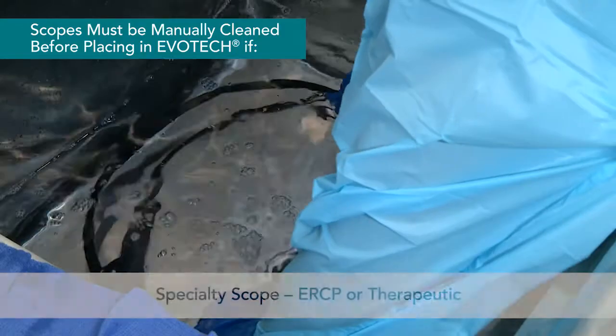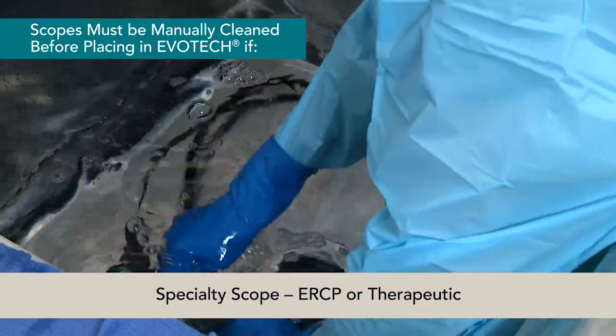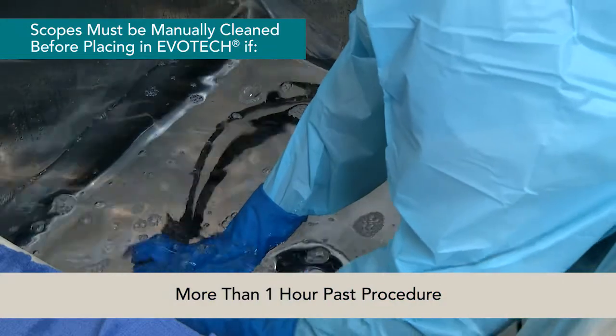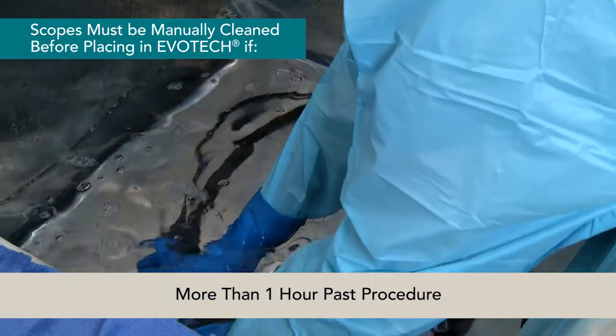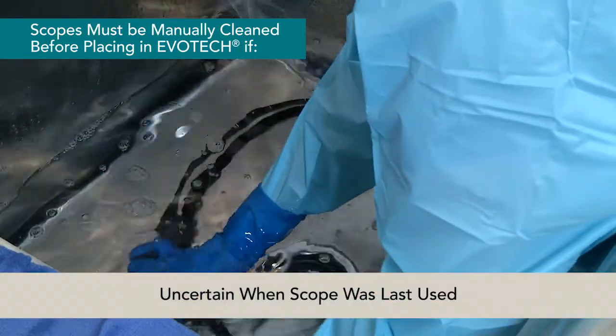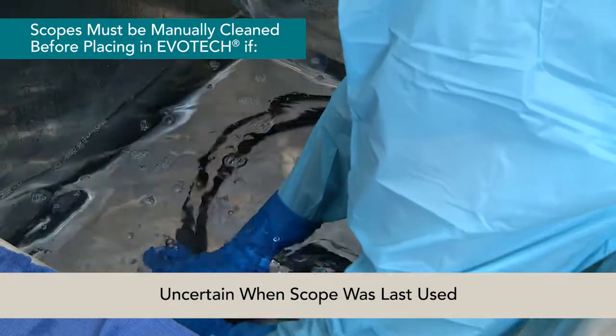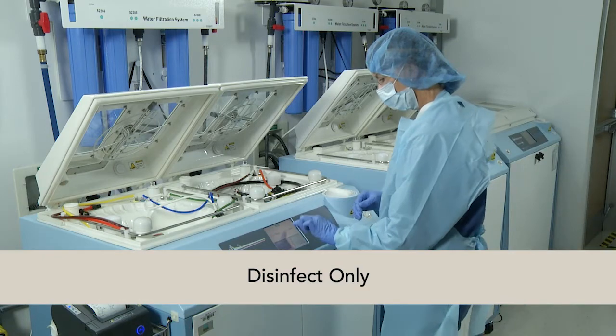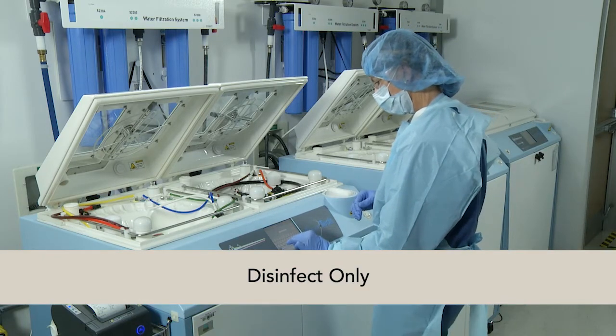if staples, stents, bands, clips, or other items were used during the procedure through a channel, if the scope is a specialty scope such as ERCP or therapeutic, if more than 1 hour has passed since the scope was removed from the patient, if you are unsure of when or where the scope was last used.